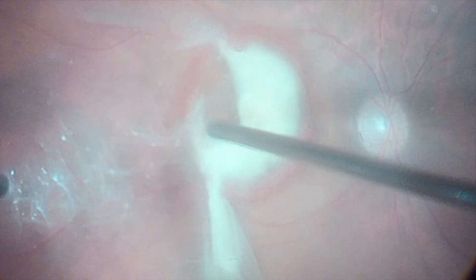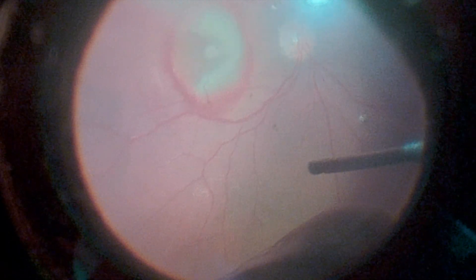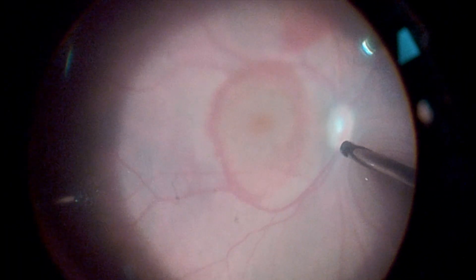After completing the peeling, the blood from the macular region is aspirated with the vitrector. The surgeon then performs vitreous base shaving. The surgery is then completed with a fluid-air exchange.